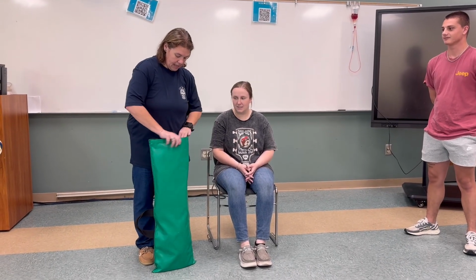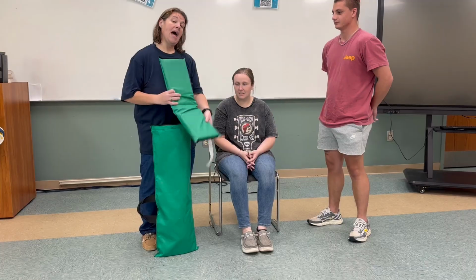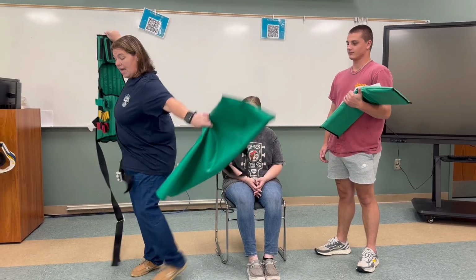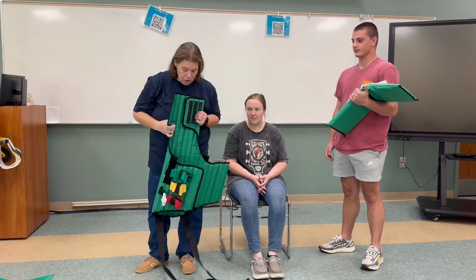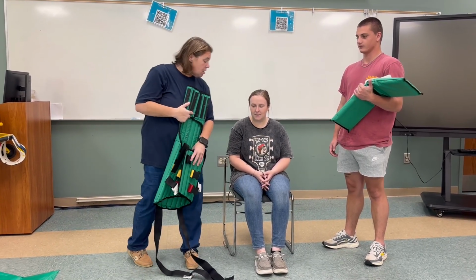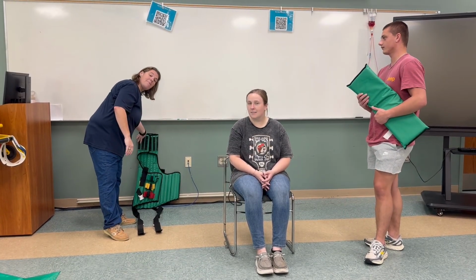So, we're going to talk about the KED first. It comes in this nice bag, and it has a head strap that we will discuss. It also has padding in case you need to pad a void. And this is the actual device that goes behind the patient. And I will show you how we do that and a mnemonic that will help you remember how to apply it. So one of the mnemonics that we use is my baby looks hot.